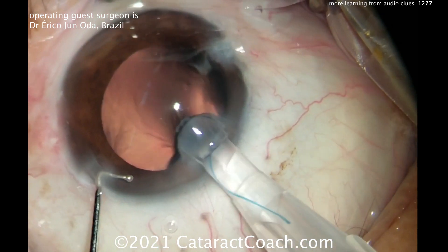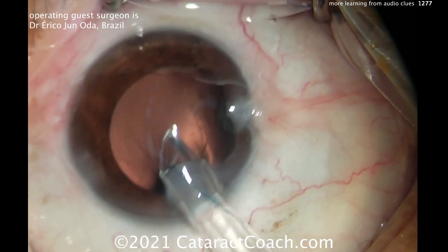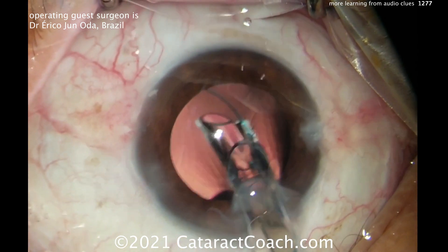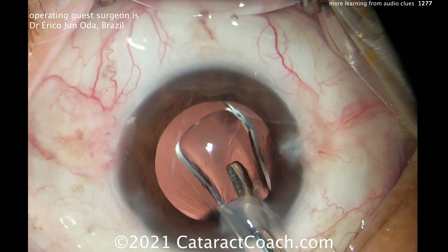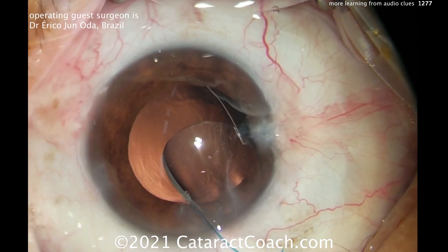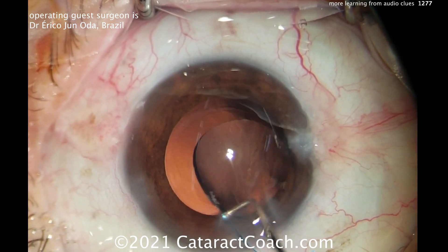Here comes the lens — looks like a three-piece lens. Looks like that first haptic is going to be twisted around the other way. Good move. Remember the 7L rule — the leading haptic comes out like a number 7, and the trailing haptic comes out like the capital letter L. That looks great. 7L looks good. Get that dialed into position.